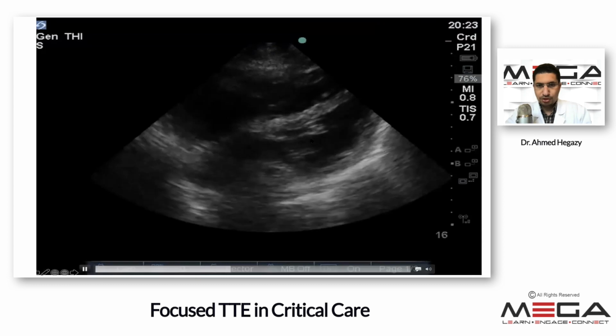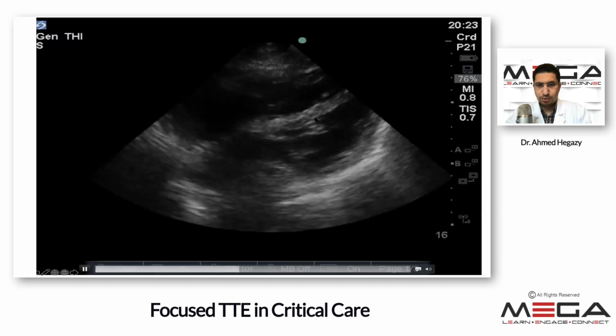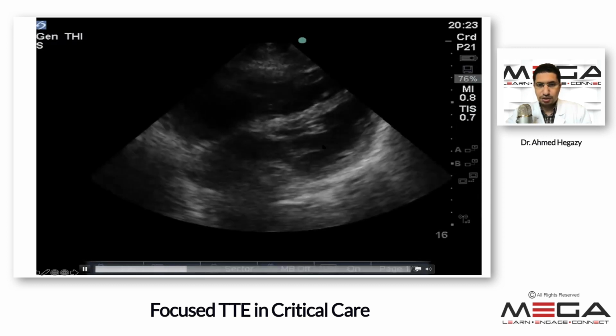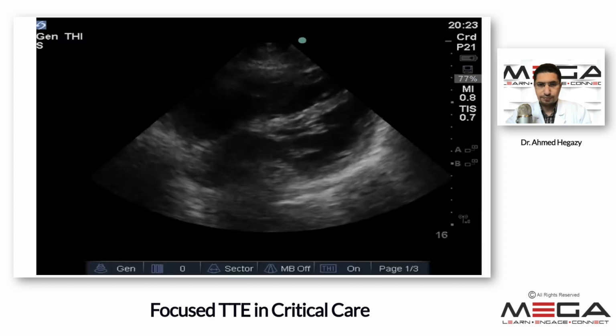This is a sono pulse check. So now you're doing half an hour of CPR, for example, and you're doing your sono pulse check, and you asked somebody to do an ultrasound, and he does a subcostal 4-chamber for you, and this is what you see. There is absolutely no movement in that heart. And so based on that view alone, you can stop doing CPR. The chances of a return of spontaneous circulation are extremely, extremely low, and that's been shown in the literature, that if you have complete cardiac standstill on your pulse check, you're unlikely to be successful in restoring spontaneous circulation.